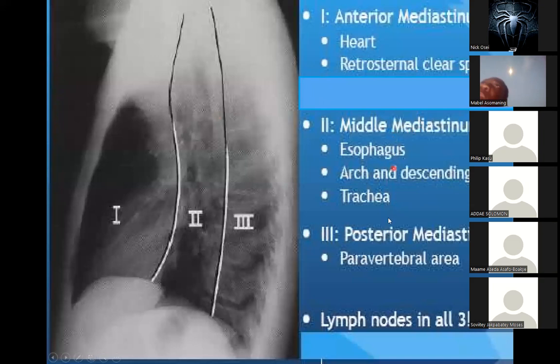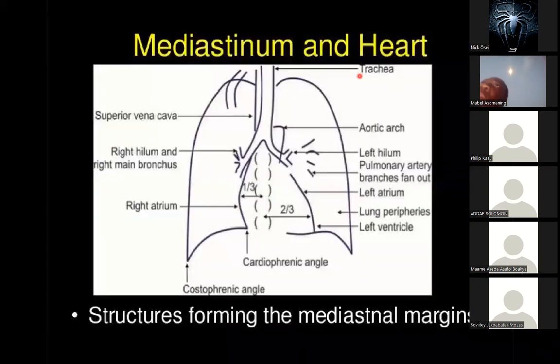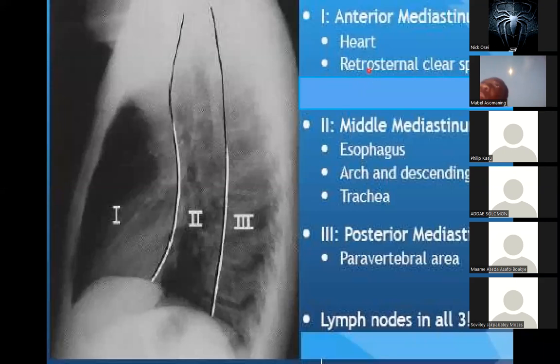That's when we can talk about the posterior mediastinum, middle mediastinum. Please don't confuse it with an AP or PA. I hope that is clear. Students usually get this as an exam question and they turn the whole thing upside down and get 0, just because they're not paying attention. So please take note very well.